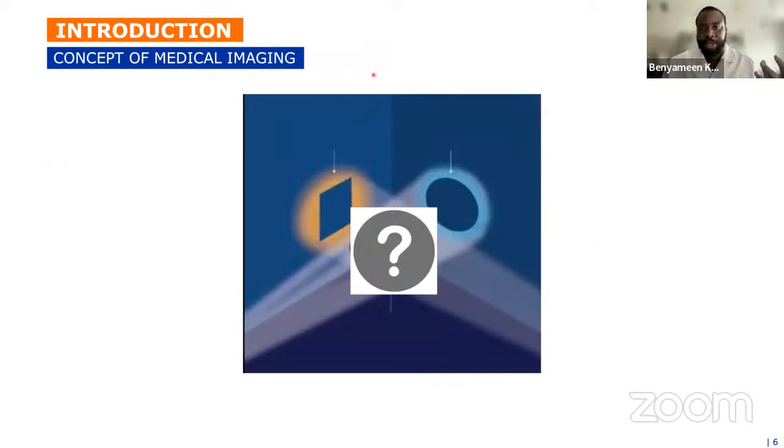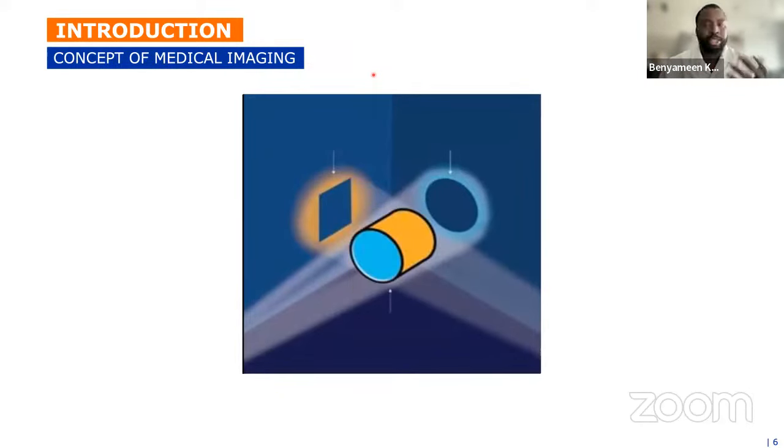If you strip down the concept of medical imaging, essentially you're passing some type of energy through an object or a body or a patient, and you have a detector on the other end, and you want to collect some of this energy, and based on that, infer some information about this object or structure. For instance, by looking at these 2D projections, you infer that the structure you're looking at is a cylindrical structure. What differs between imaging modalities is the energy that is being used.